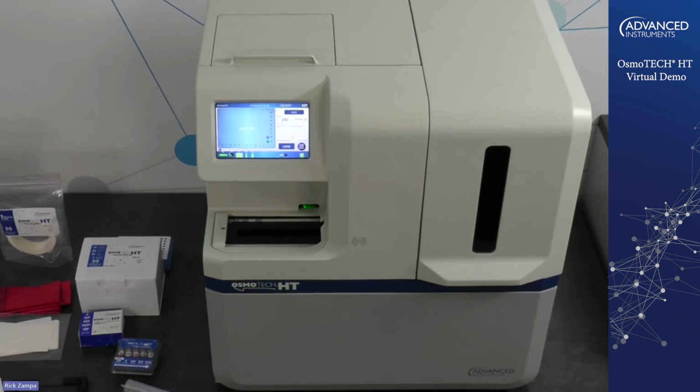So we say, I'm going to have to look at the manual because I thought we always said 180. So it's 180 because, what happens is we're pipetting 20 microliters of sample into each sample cup when we run a test. However, we require 30 microliters of sample to pipette 20 microliters of sample. That's just the way the automated pipetters work.